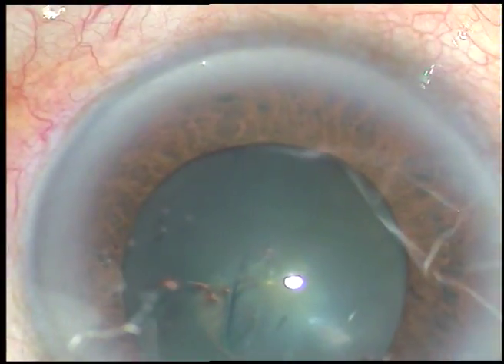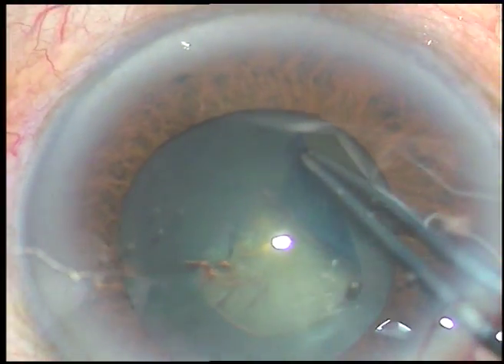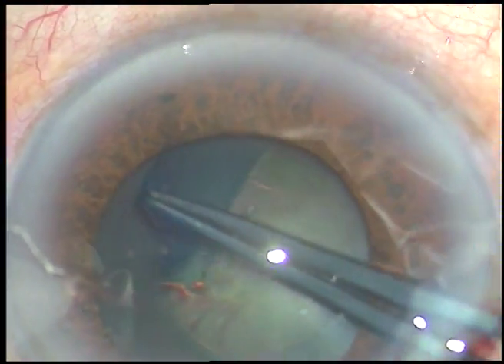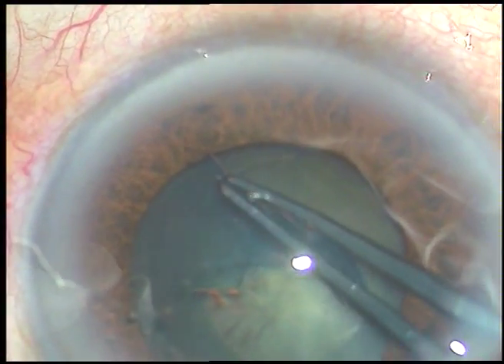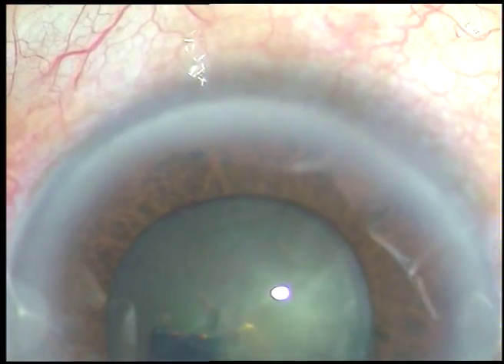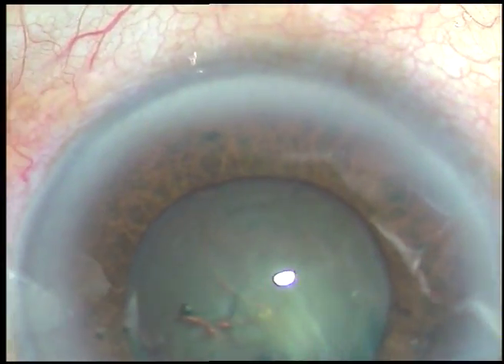While I am doing the capsulorrhexis, I must take care not to touch the iris because it will become much smaller immediately. As some viscoelastic substance is coming out, the pupil is getting smaller. The patient is under topical anesthesia, so we have to be more careful not to touch the iris.